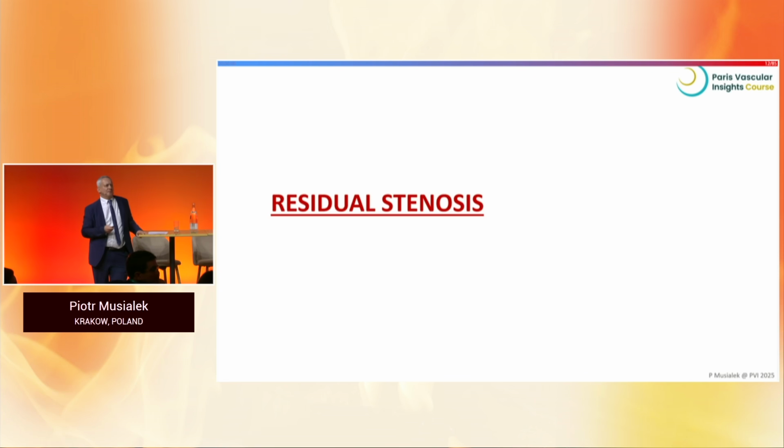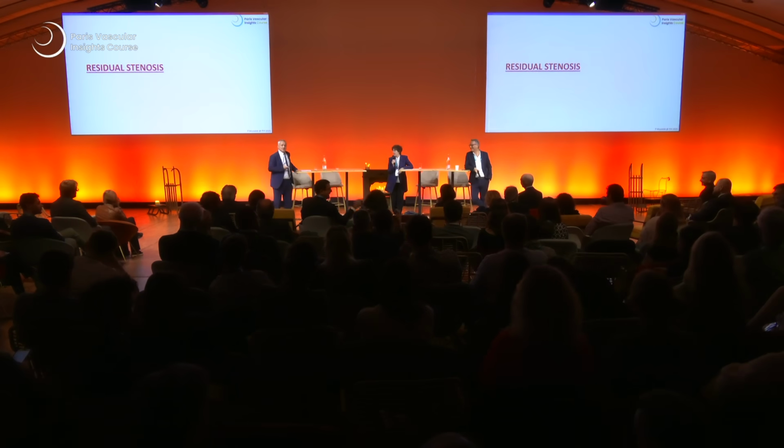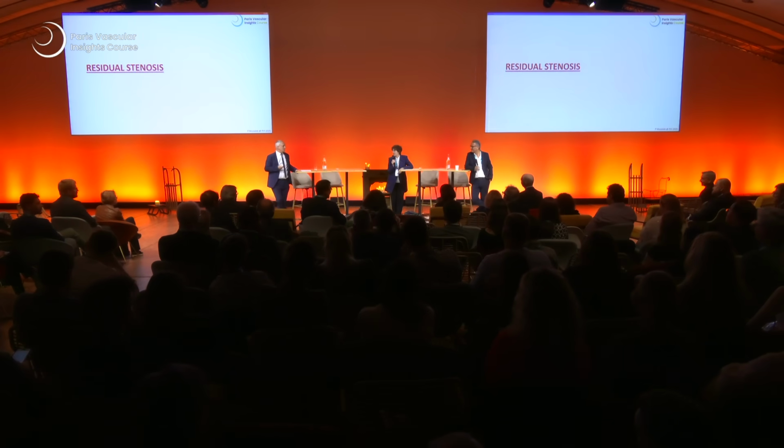Well, it depends. If it's a symptomatic patient, especially with hemodynamic features, they will not be doing too well. And also, you get told off by your colleagues who don't believe in carotid artery stenting. They say, see, it doesn't work. Okay, that's an argument. Any other problems with residual stenosis? How much residual stenosis?